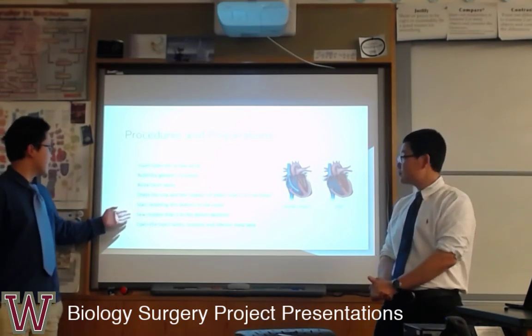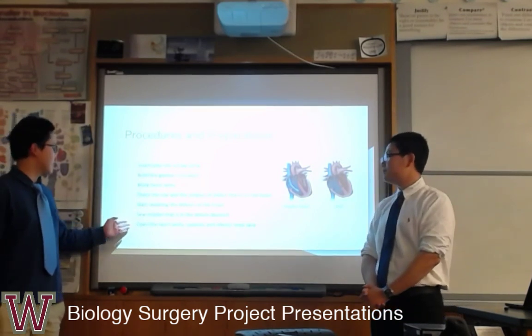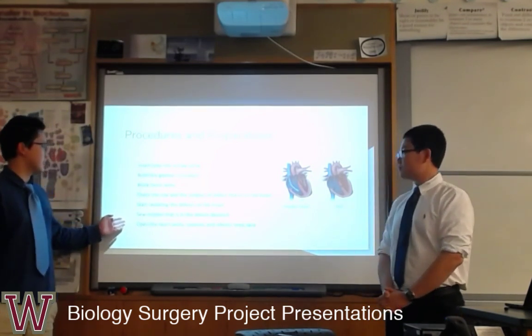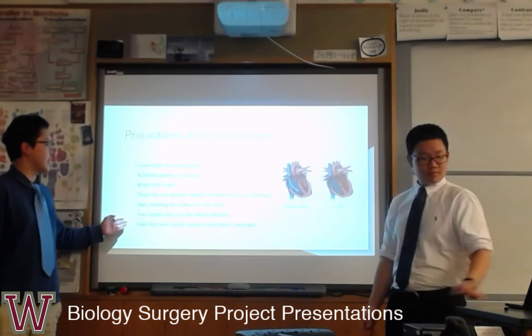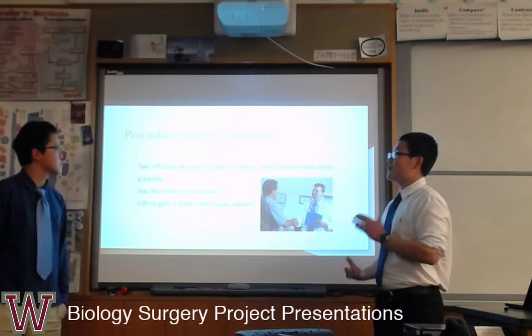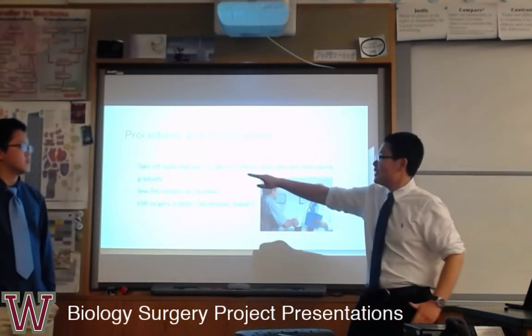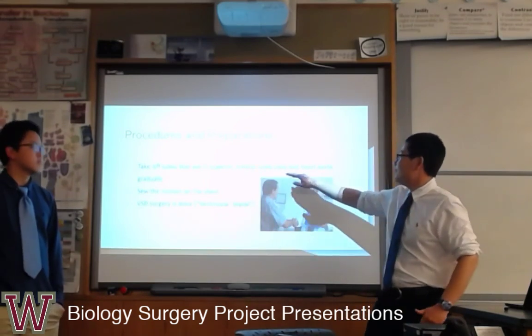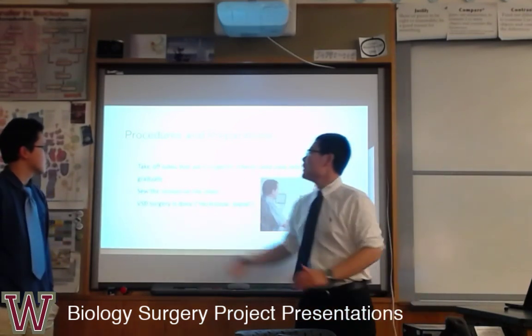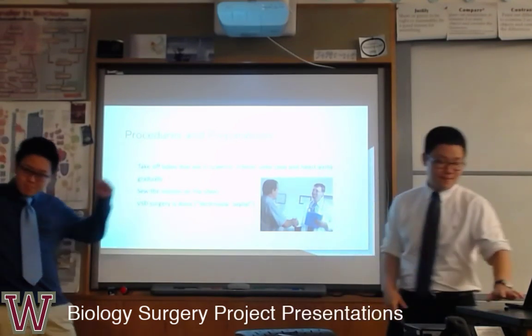After that, they must sew the incision back on the right atrium and then open the heart aorta and the superior and inferior vena cava. There are just several steps that the doctor needs to do. First, the doctor needs to take off the tubes in the superior and inferior vena cava and heart aorta gradually, and they also need to suture the incision of the chest. Now the surgery is done.